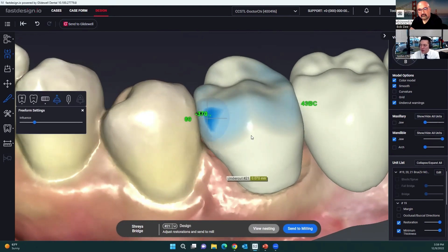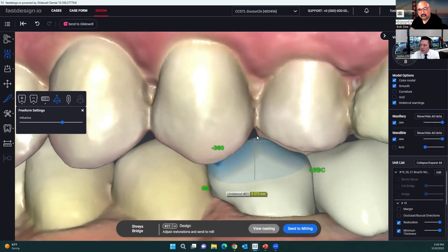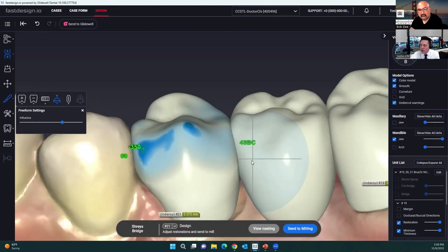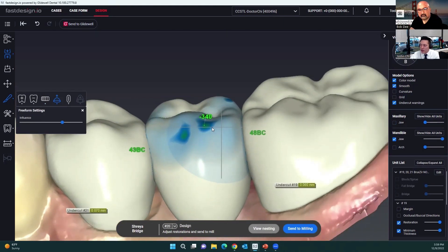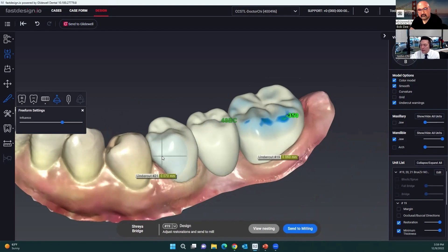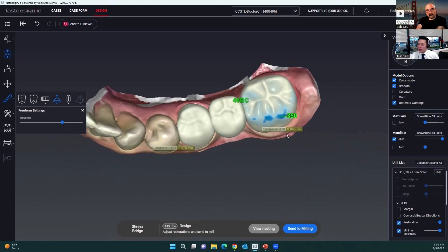So just a minimal change — we're no longer really hugging that mesial neighbor. If for any reason you wanted the contact area to be a little heavier, you can bring the opposing model up to see the contact on the cusp tip on mandibular posterior teeth. There are little things you can do to modify the design for functional areas or aesthetic areas as well.